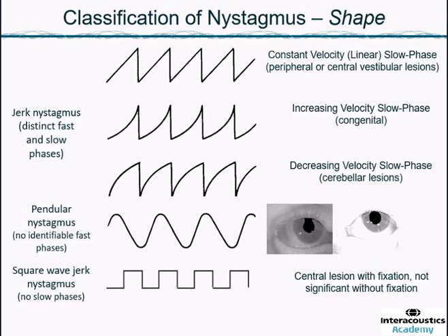Normally your saccades are under voluntary control, but in some abnormalities you lose that voluntary control. So the eyes are getting thrown off the target, and then you try to come back to the target. The width of these square wave jerks is always about 200 milliseconds. That's the intersaccadic latency. So the types where the eyes are staying constant are usually right around 250 milliseconds or so.